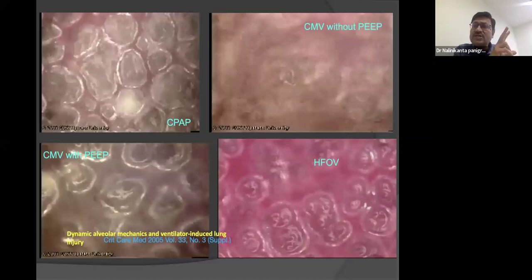In conventional ventilation, there is a sync in the oxygenation and ventilation. When we are trying to achieve oxygenation, probably we will wash out the carbon dioxide by hyperventilating. Sometimes we want to ventilate the lungs with higher rate, higher tidal volume. Probably we will injure the lungs and indirectly increase the volume of the lungs, and more oxygenation will also happen with the higher ventilation settings. So they work in sync.